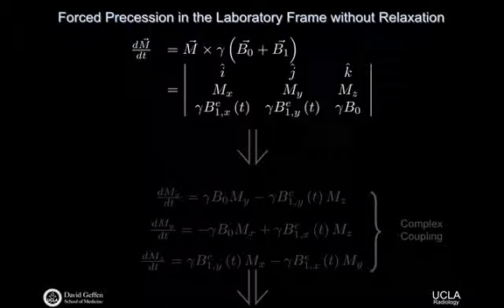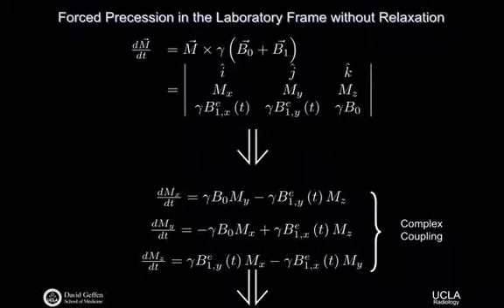So we've set up the problem at this point. We've said we have a spin system. This is our B field that's being exposed. And now we're left to setting up the system of differential equations that falls out of that determinant, okay? And so we just look at the first term, dMx/dt, and I have to do the determinant of this guy, and I'm going to have a gamma B0 times My, and then I have to subtract off this term here, and I get a minus gamma B1 times Mz.